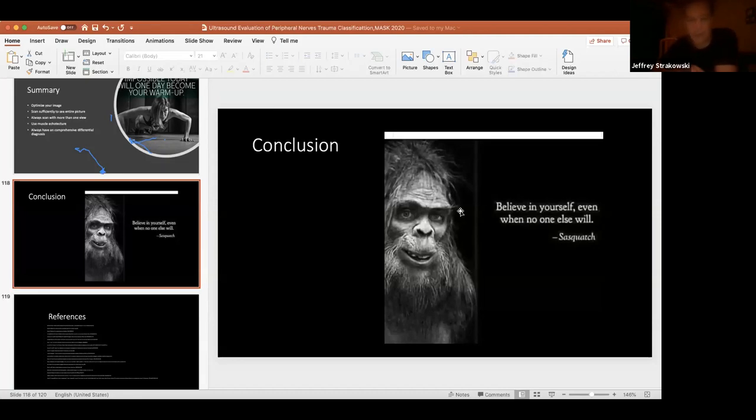There've been a few papers on it, but that's something we need more work on, I guess. Even with ultra high frequency, we can see some structural changes sometimes, but I don't think it would distinguish nutritional versus other generalized things. And part of that would depend on everything being a spectrum, right? The more severe the neuropathy would be, the more likely we would be to see some of those changes, but that would still be fairly nonspecific.